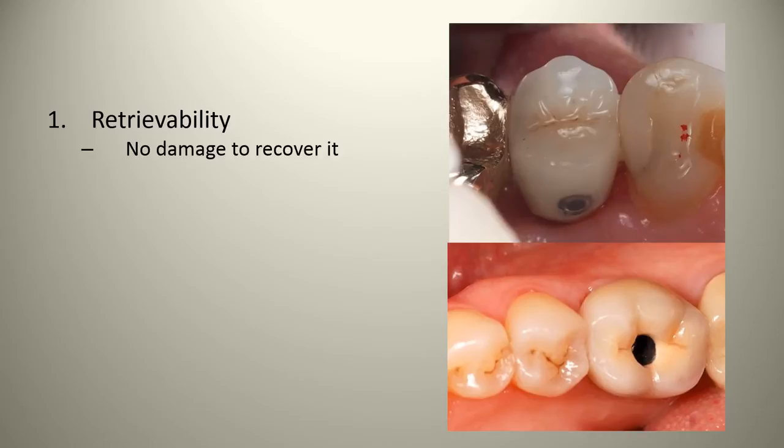There's other things about accessibility of the crown or underneath the crown, the aesthetics. So if you take a look at the picture here on the bottom, obviously a hole going right through the occlusal surface of the tooth is not going to work for some people. They paid lots of money. They want to see something that looks like a tooth. Many times it comes down to angulation of the actual implant. So if you have an implant in the maxillary anterior and the screw is going to be coming out on the buccal aspect of the incisal edge and you have to cover this up, there are excellent means of masking the metal and the porcelain and getting a nicer fiber optic effect with some of the newer composite resins that are available out there.